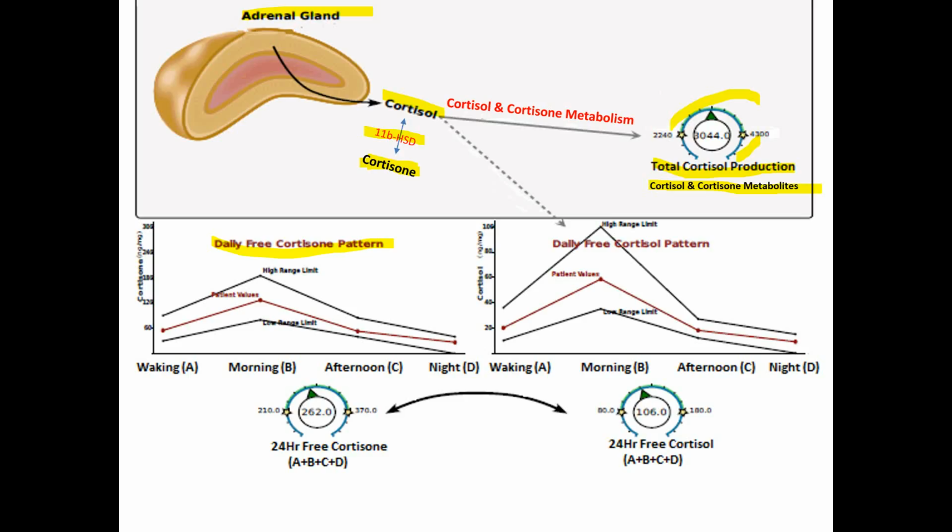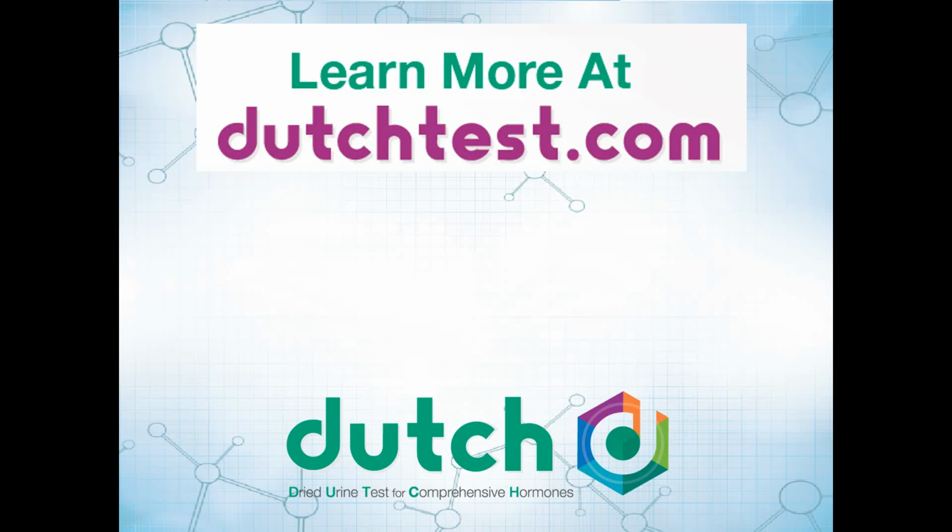The other bit of information we can see from the data is which is predominating, cortisol metabolites or cortisone metabolites, and that is a helpful piece to the picture sometimes, as it helps to clear up kind of what's going on and how do we want to really characterize this patient's cortisol overall. And to do that, we want to look at free cortisol over time, the total of production, and then any metabolic preference that there might be, and again, taking that all into context of any potential supplementation with a glucocorticoid that might be affecting that.